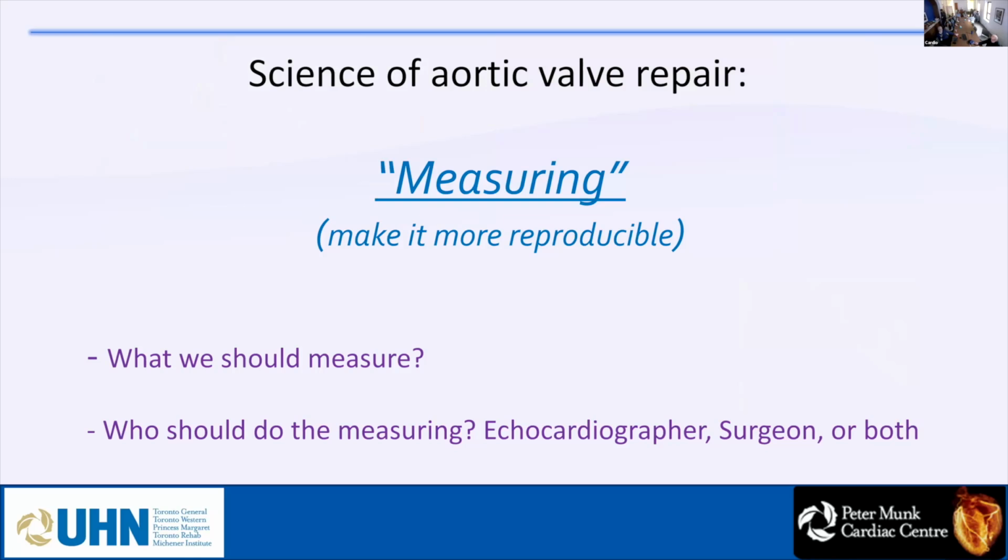So what should we measure and who should measure it? Surgeon or echocardiographer? I believe the echocardiographer should be able to measure everything the surgeon can measure and give the surgeon the information in advance, so the surgeon can make a decision, even the day before. The surgeon can say, okay, based on the measurements the echocardiographer did, your valve is repairable.